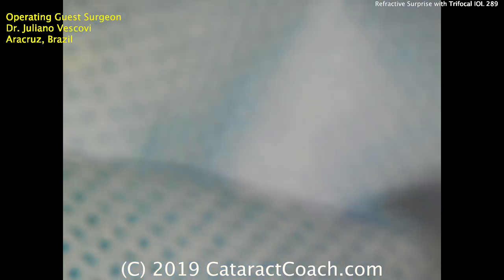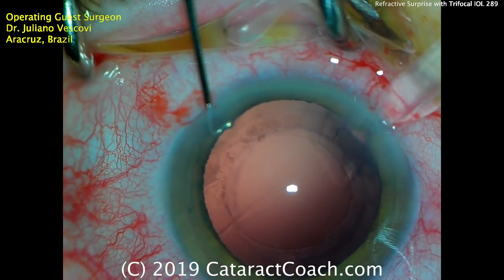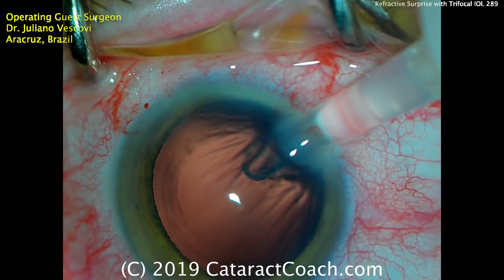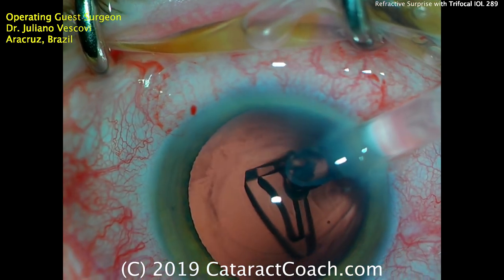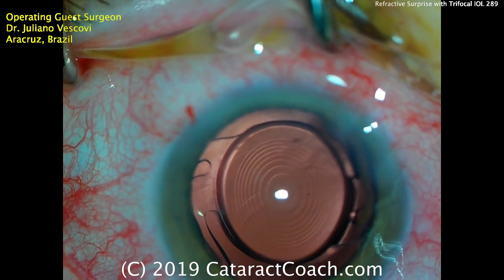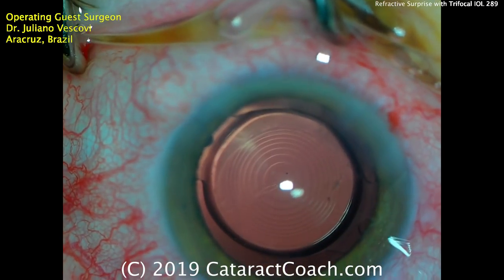Here's the injector — there comes the lens being verified under the microscope. Back to the eye — the eye is fixated with the chopper, a nice technique. The lens injector is advanced and the lens delivered. There's the injector tip inside the eye, advancing the lens down the plunger — here comes the leading haptic, the optic (looks like an acrylic material), and now the trailing haptic. The lens is placed in the capsular bag with a nice 360-degree overlap of the capsulorhexis. That looks great.